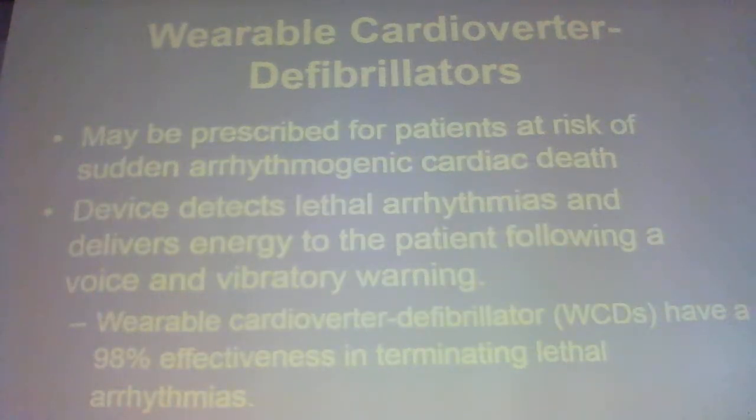All right. Who knows what this is? It's a life vest. This is typically what we're seeing now. People are put in for 3 months before they get their AICD.